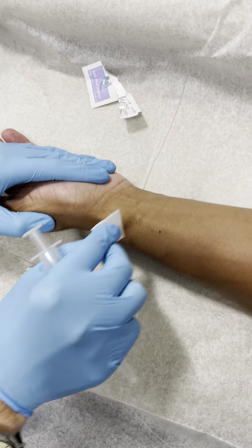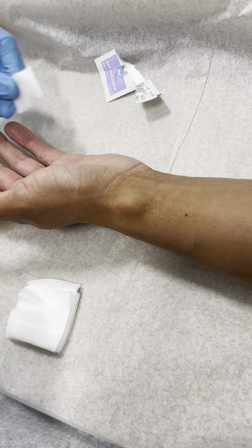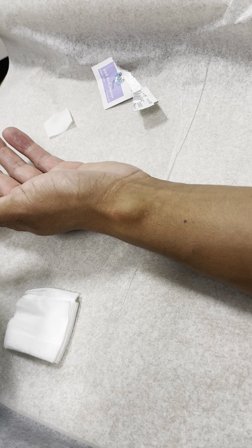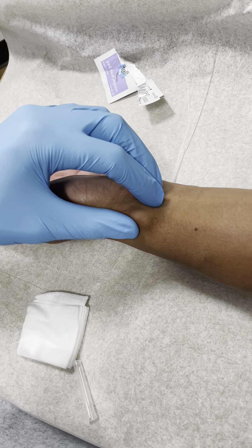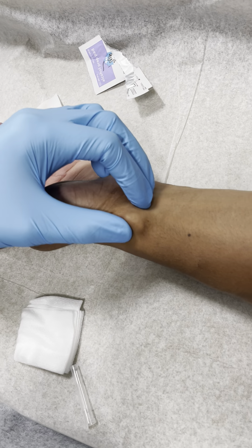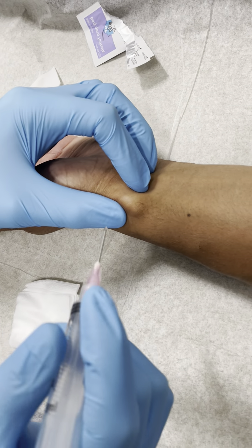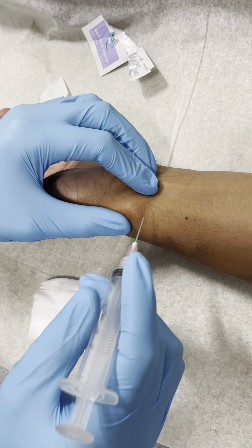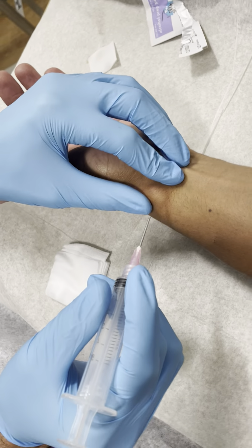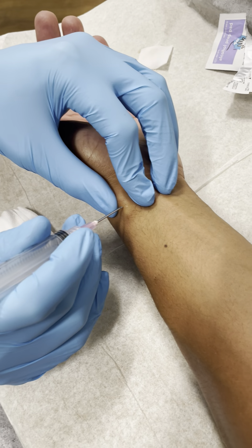I'm just going to clean it off with some alcohol. This is a ganglion cyst, and you can see that it's a nice cystic structure. We're using an 18-gauge needle, and we're going to be careful to avoid that blood vessel there, so I'm just going to move that out of the way.